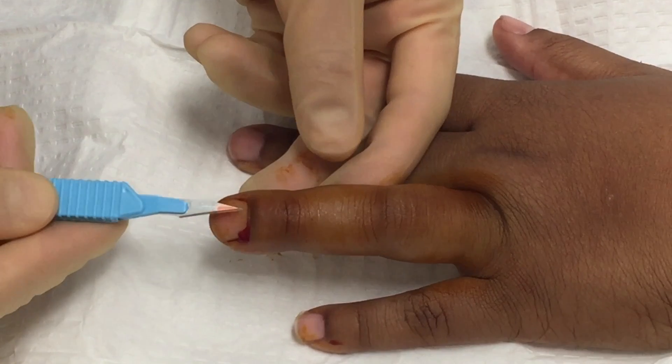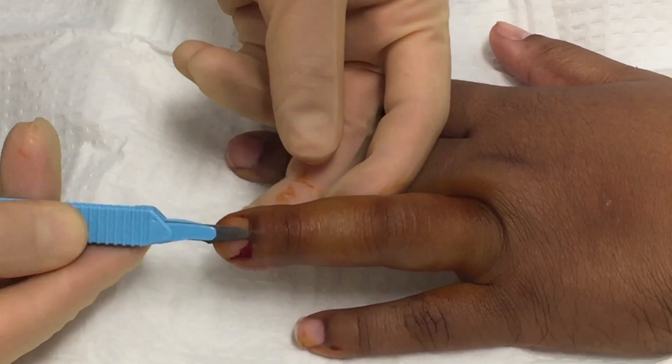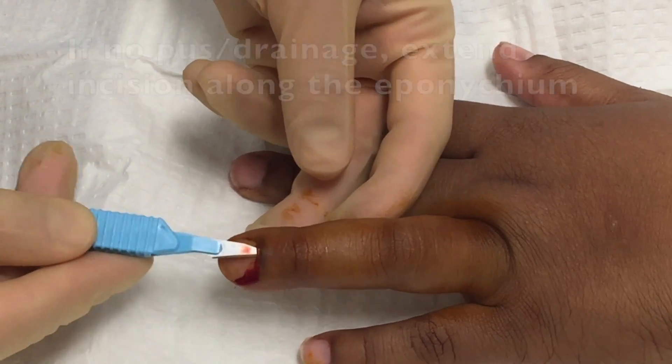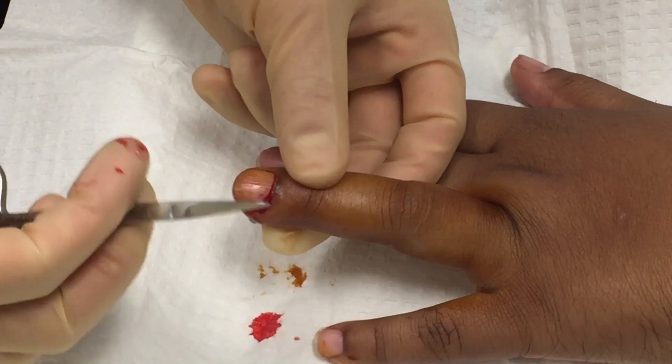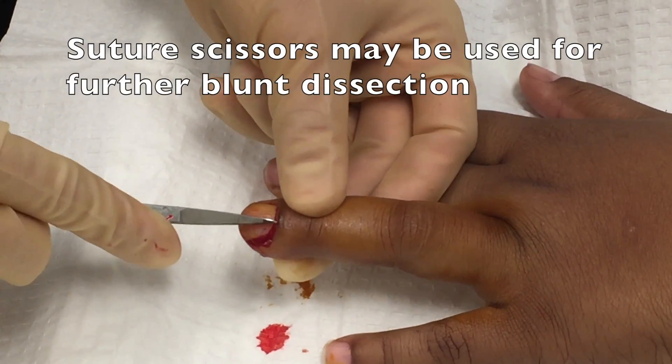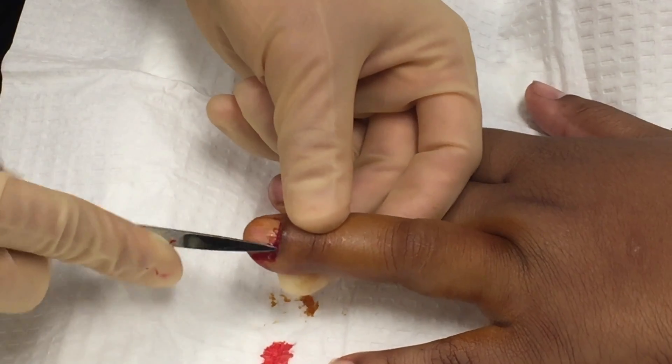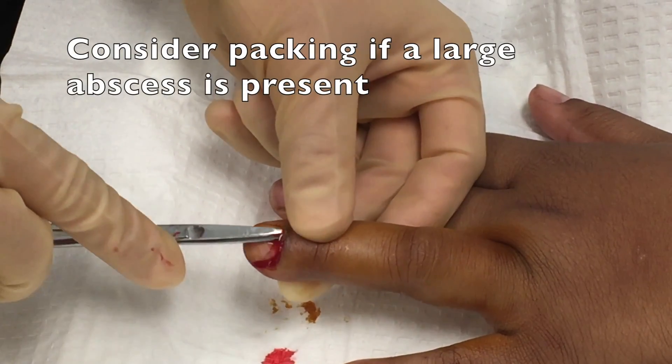Now if no pus or drainage comes out, as was the case here, you'll then extend the incision along the eponychial fold to make sure you haven't missed a small pocket of pus. If that also fails, you can take a pair of suture scissors and bluntly dissect along the same tissue plane to see if there are any small pockets of pus that are trapped.